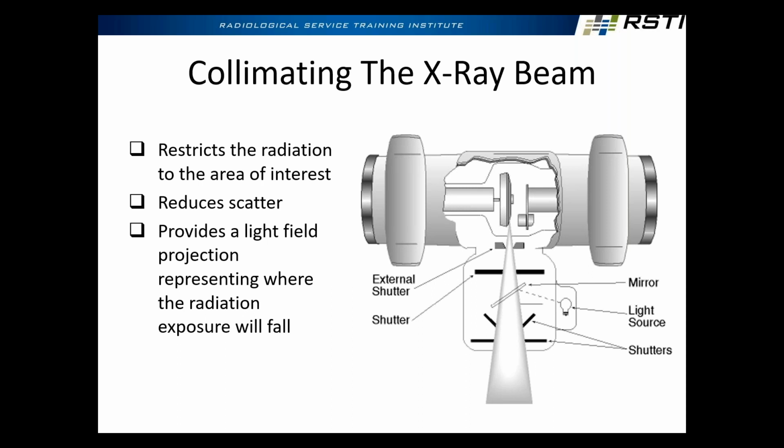You might have to select that. And yeah, we can probably do this on the small focal spot, so we'll already have that selected for you. It's pre-selected everything for you, all right?